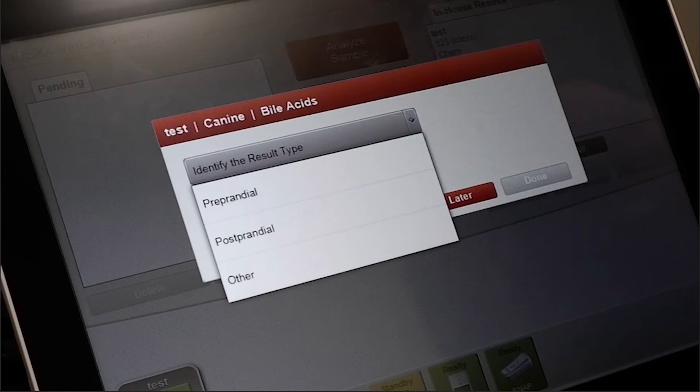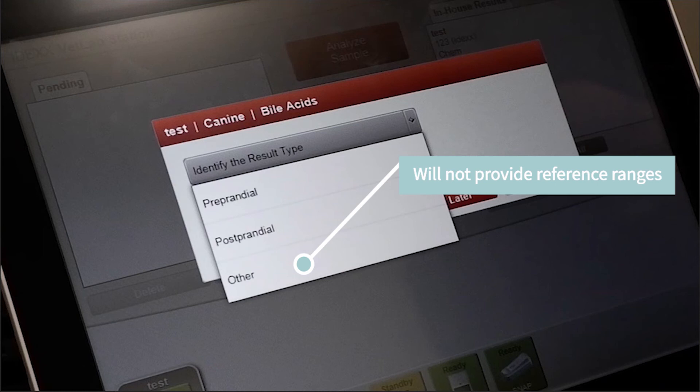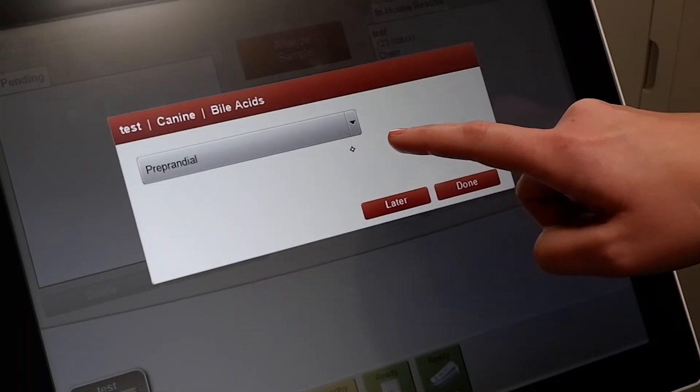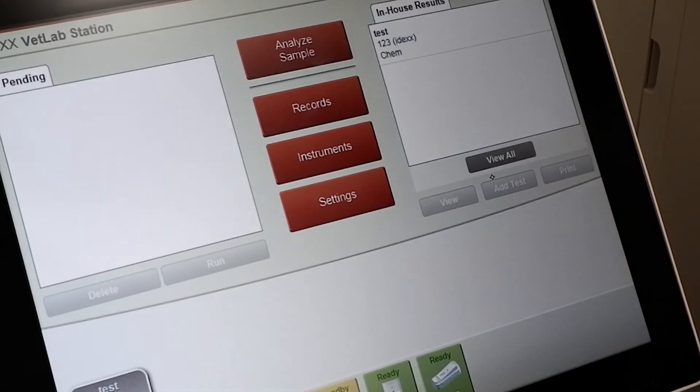If you do not select pre or post, the results will remain pending until you do. You can also select other and the results will go final. However, you will not have reference ranges.